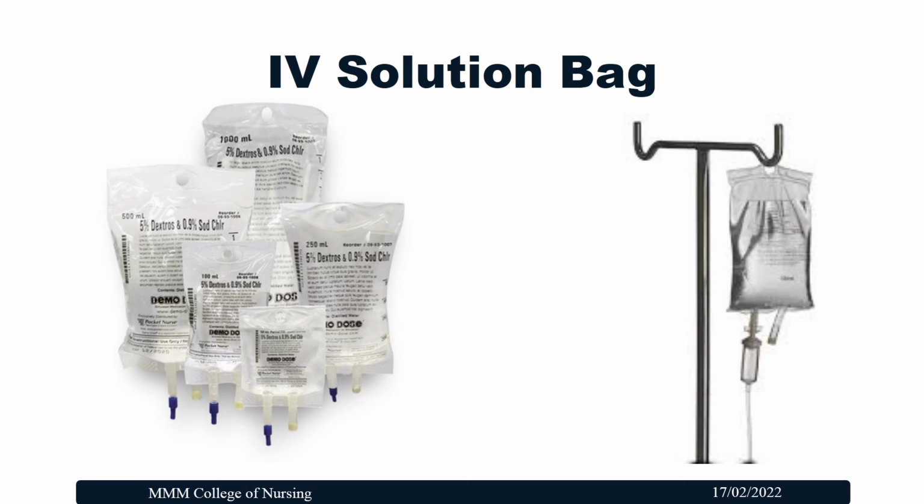The IV bags are prepared with the FFS technology. That is, it will form the bag, fill the bag and seal it. All will be done with one machine. The main aim is preparing and administering the fluids in a more sterile manner. It is a completely collapsible bag, so there is no need for any air vent. Throughout the infusion, the closed system can be maintained.